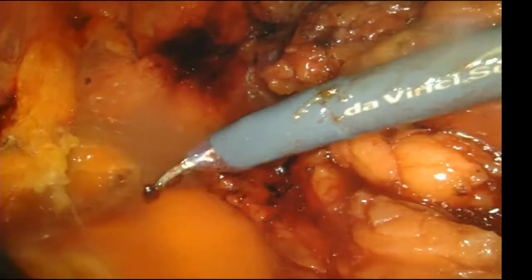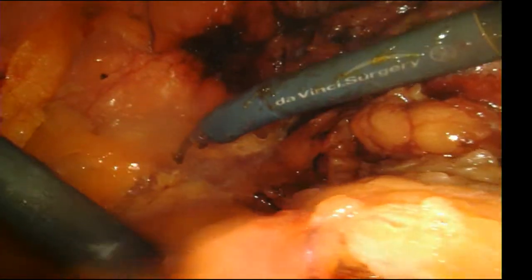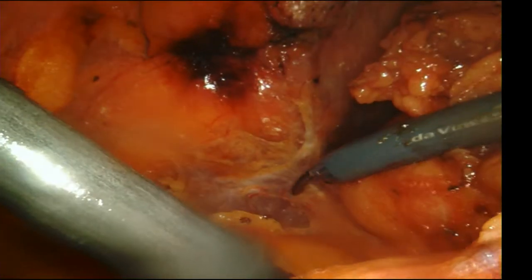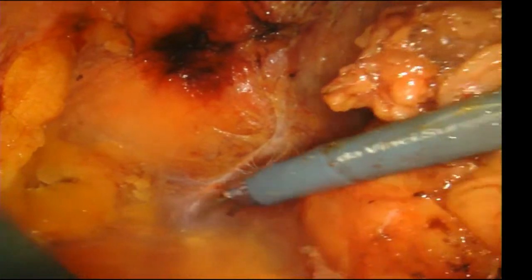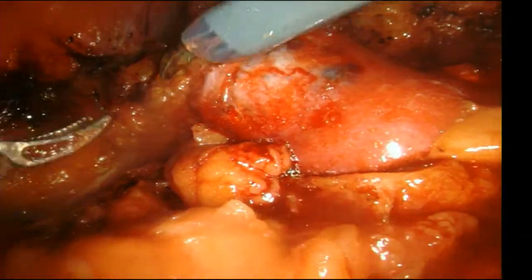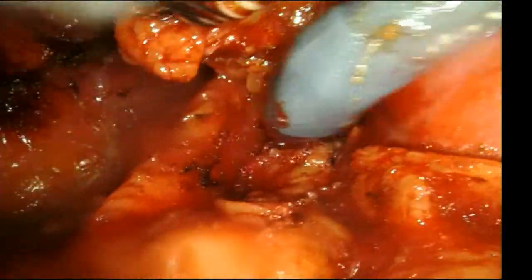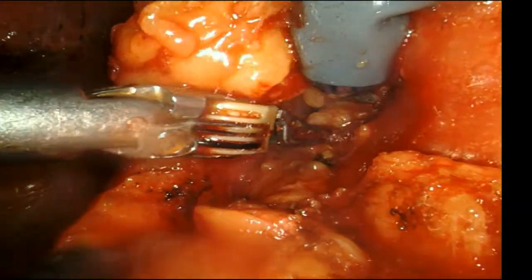What's your positioning, Dr. Abaza, for retroperitoneal? Are you flexing the table and putting full flank? Yeah, I put them in 90 degrees, and then we max out the flex on the bed. Yeah, it's kind of necessary. I don't think you can get around it without flexing. There's just no way. Most of our patients, especially the obese ones, there's just no room between the rib and the ASIS. Certainly the Xi has revolutionized the retroperitoneal approach.